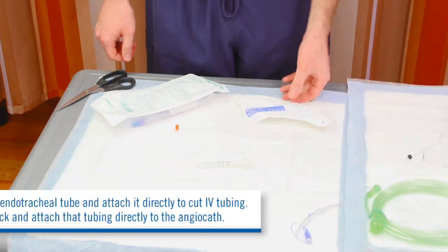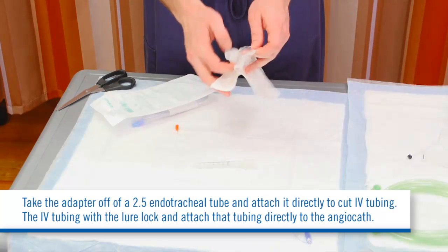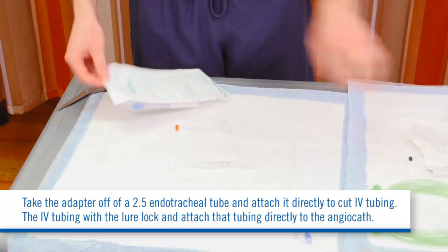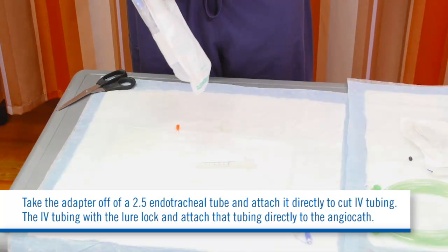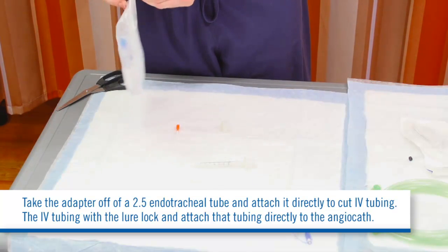Number 3, take the adapter off of a 2.5 endotracheal tube and attach it directly to cut IV tubing, the IV tubing with the Luer lock, and attach that tubing directly to the angiocath.